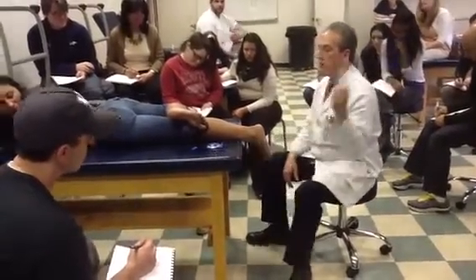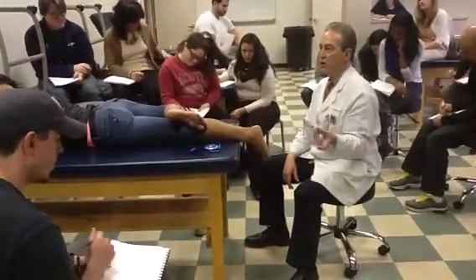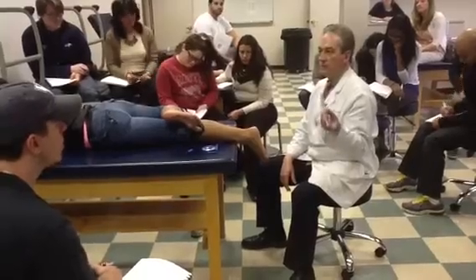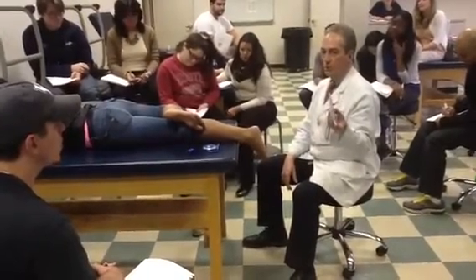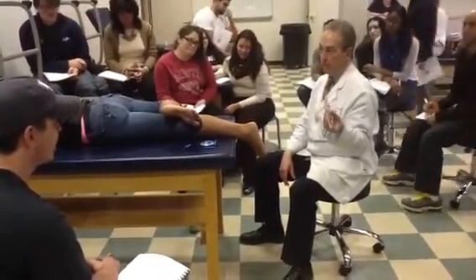I'll show you how to use the OED first because I think this is the easiest and most accurate way to do it. And I'll show you two ways to do it. One, an okay way to do it. Two, the Dr. Spencer best way imaginable in the whole universe way to do it.